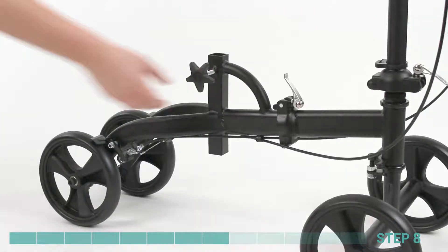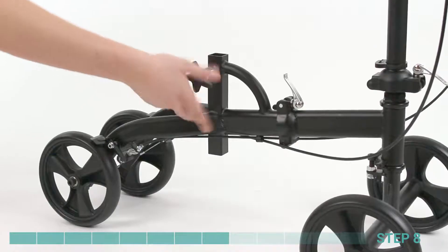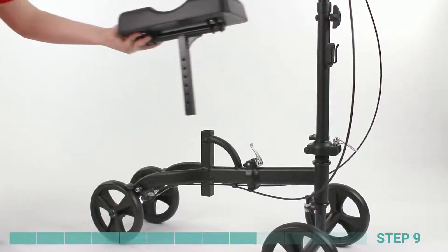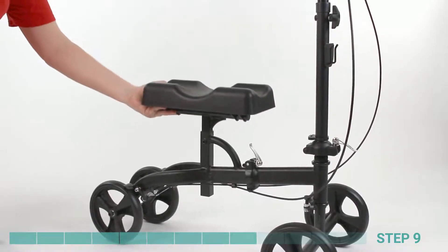Step 8. Unscrew and remove the adjustment knob from the hole at the top of the knee pad base. Step 9. Insert the knee pad pole into the knee pad base.